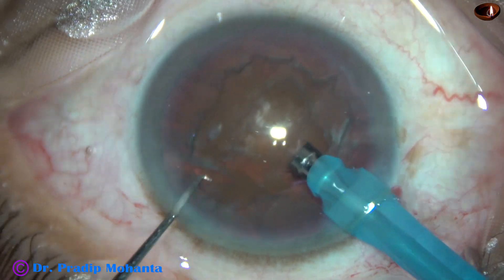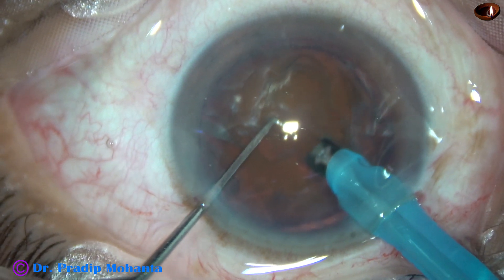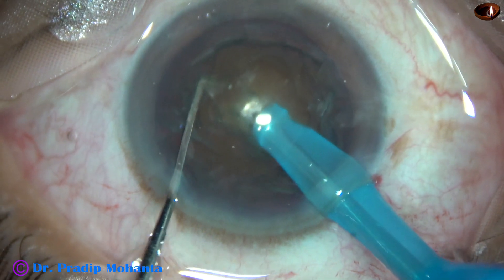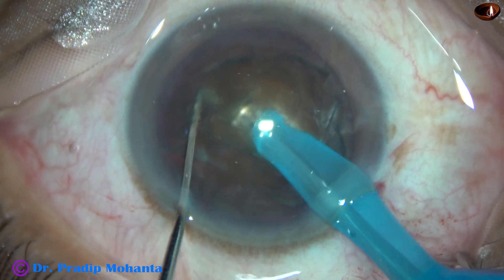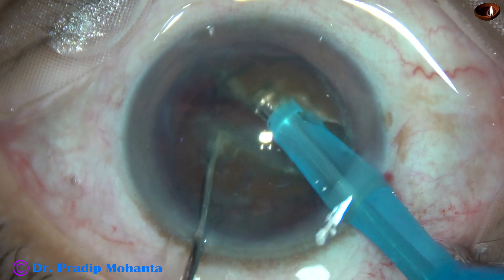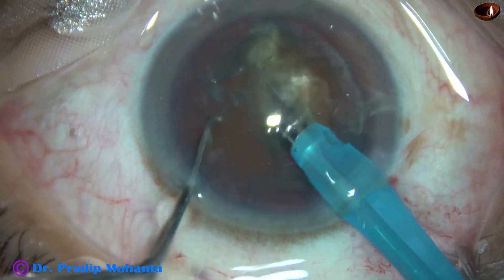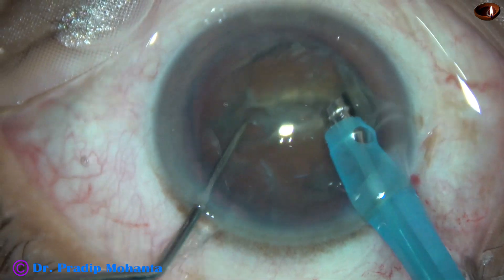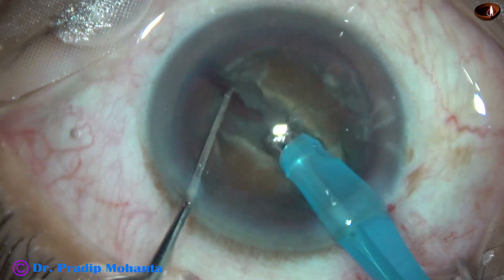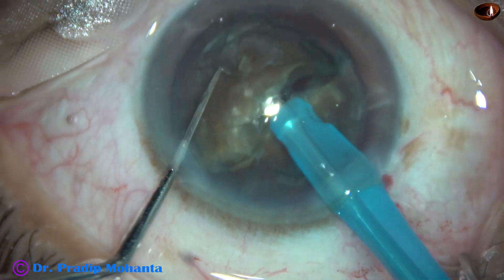Watch submarine chop. The tip goes into the substance of the nucleus just in front of the main incision, and goes through the substance of the nucleus towards the opposite equator. As it reaches near the opposite equator, the chopper is used to divide the nucleus. Then it is rotated 180 degrees. A few more strokes go to a deeper plane and divide the nucleus completely into two heminuclei.